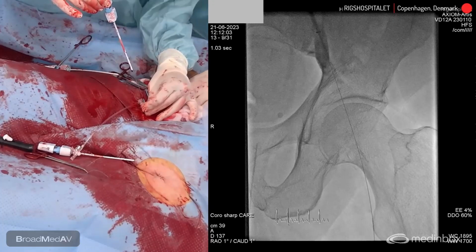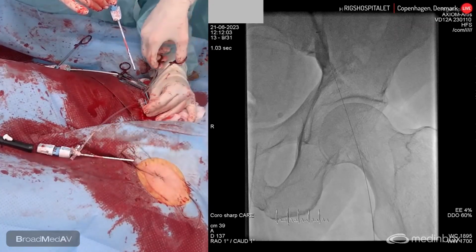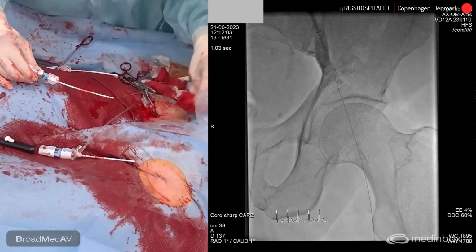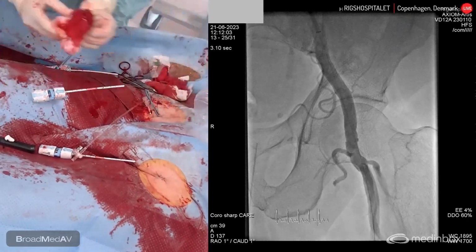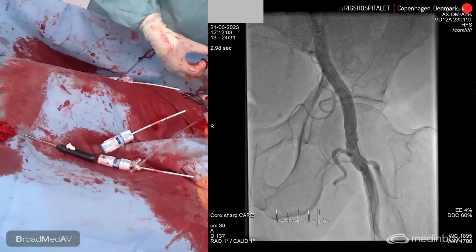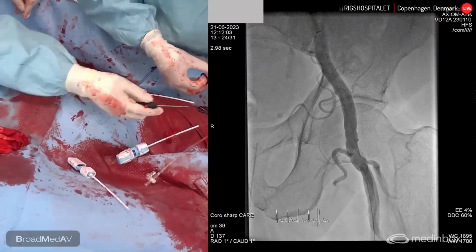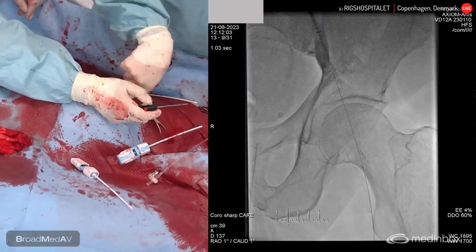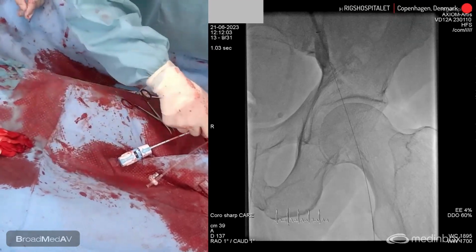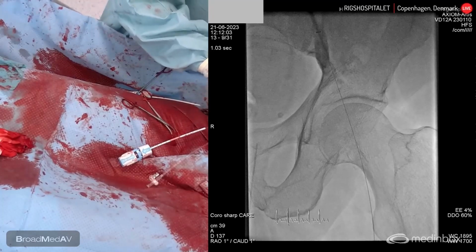The final thing. I'll take this here. Voila, now we're done, I think. Indeed, looks good. Just a bit of manual compression here. Now you can cut everything. It looks completely dry. It's really good. You see, we can do it successfully. Any situation, you can always solve.